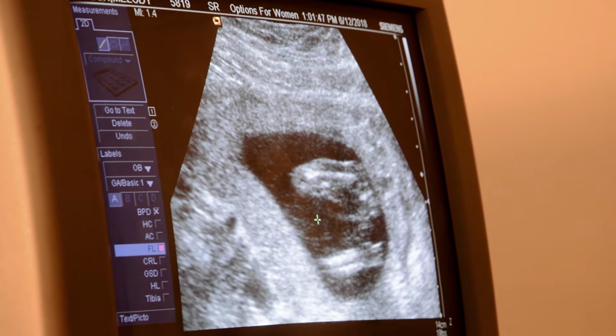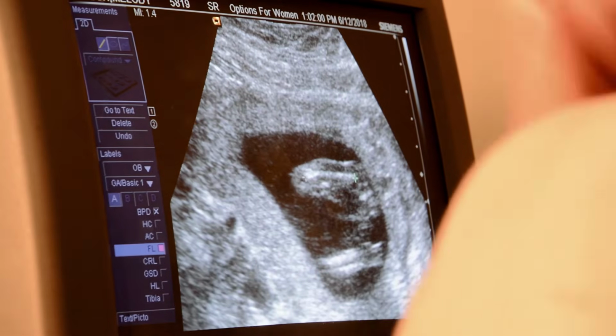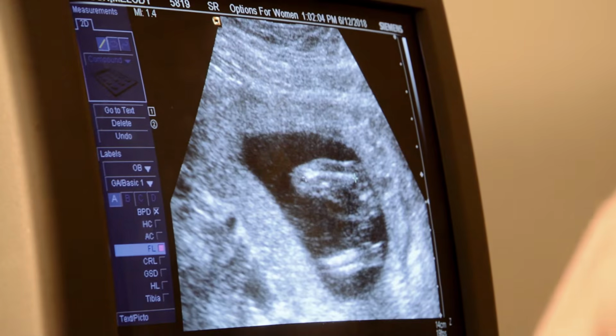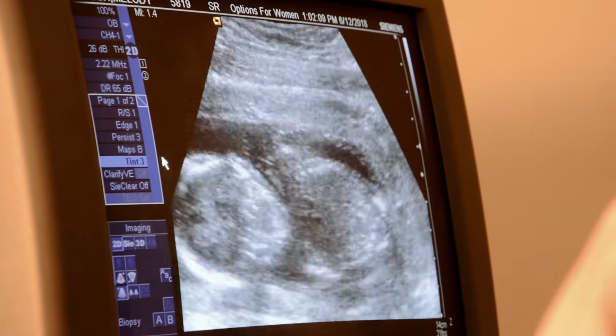And you know what? On this one, I don't know where the end is. Let's see what we got here. Yeah, 18 weeks, 3 days. So you might be a week further, but it's plus or minus 2 weeks at this point anyhow, so it doesn't matter. So we'll go ahead and take this picture. Okay, and freeze.